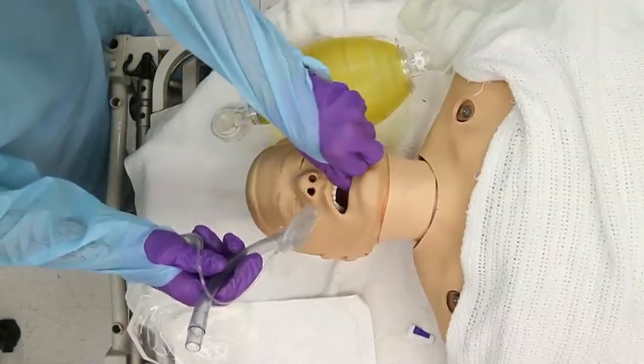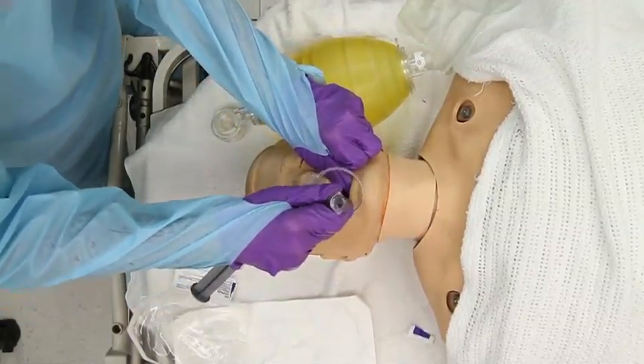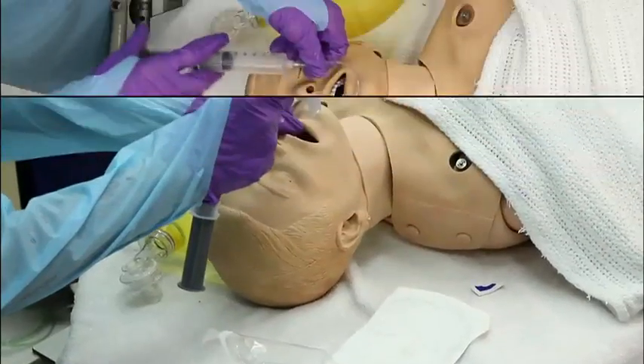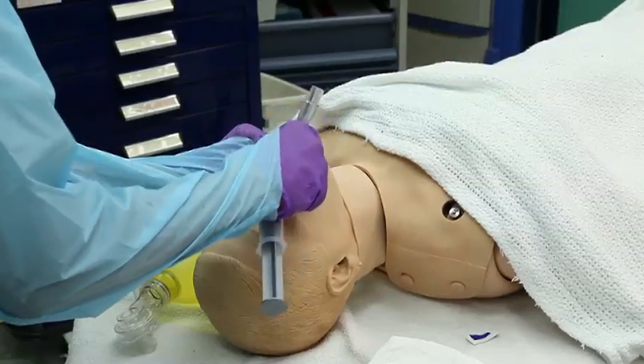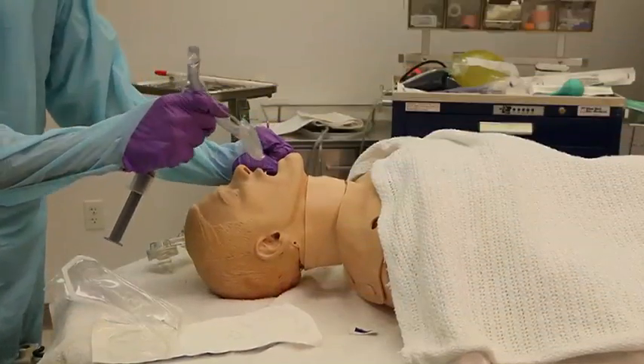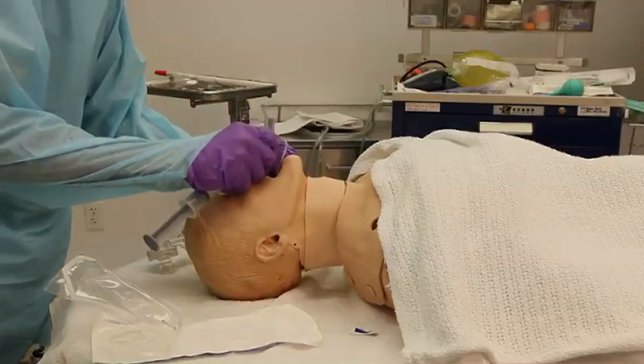Hold the LMA with the dominant hand as you would a pen. Pass the LMA behind the upper incisors. Push the lubricated LMA into position along the palatopharyngeal curve with the index finger maintaining pressure on the tube and guiding the LMA into the final position.